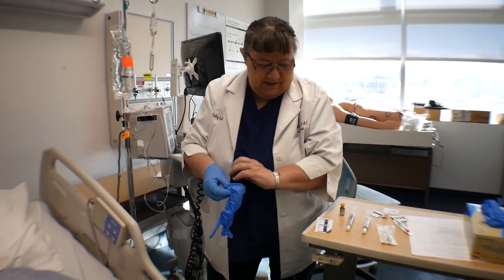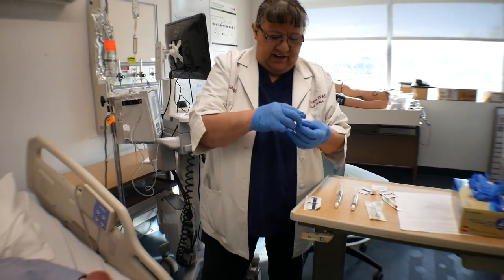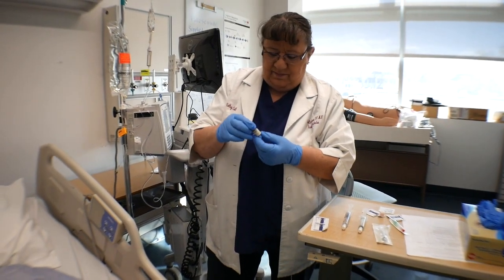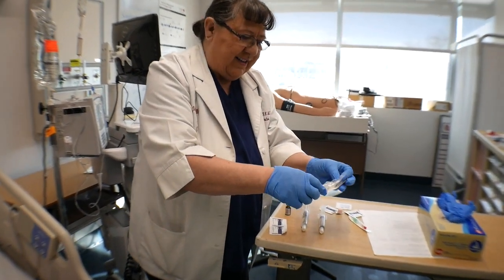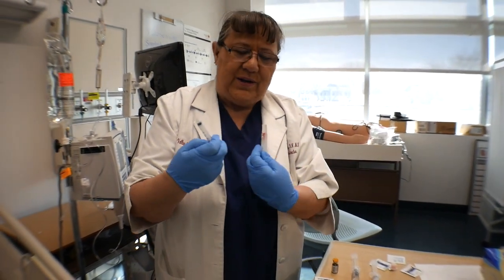And it looks good to me so far, so I think I'm going to go ahead and prepare my medication. So I've already scanned it. I have my furosemide. This one happens to be 20 milligrams per milliliter, so I'm going to draw up 1. So I got the appropriate size needle. It's 3 milliliters. And then this is a twin pack.